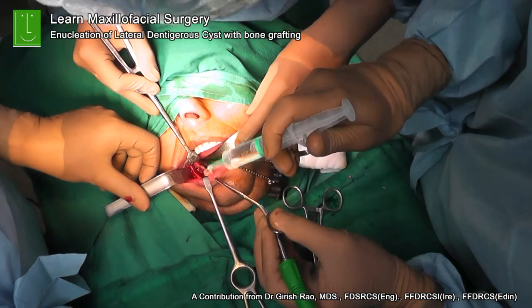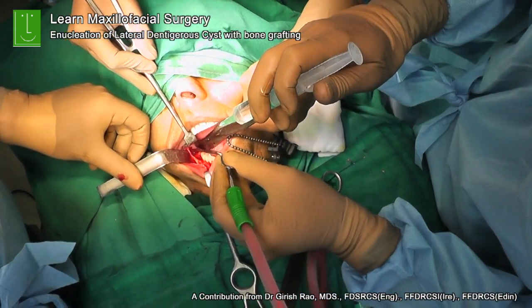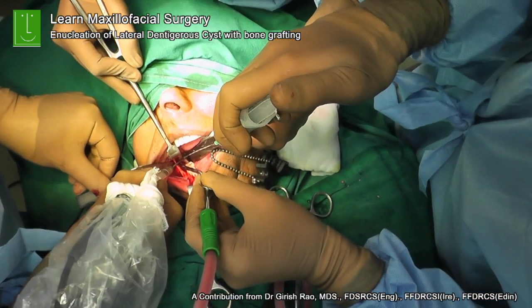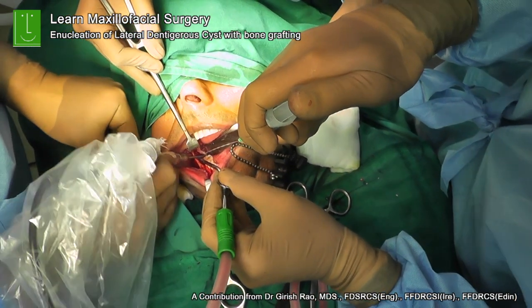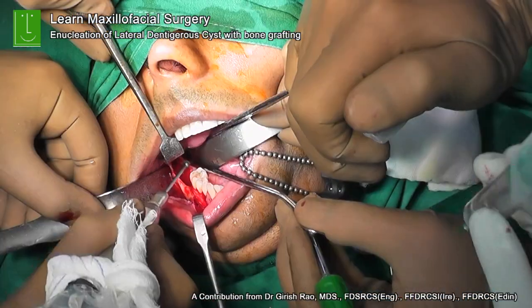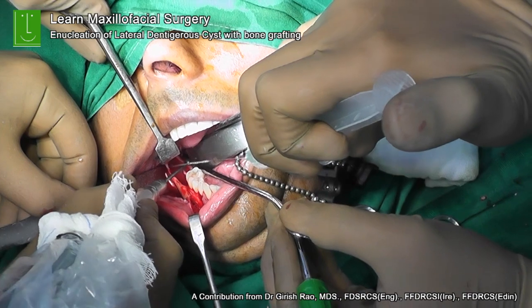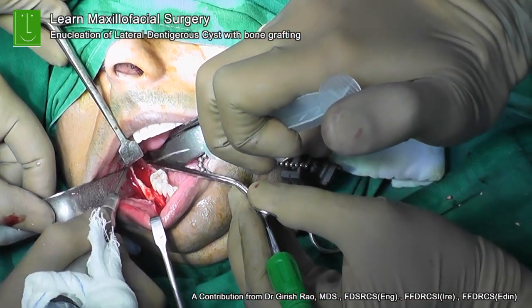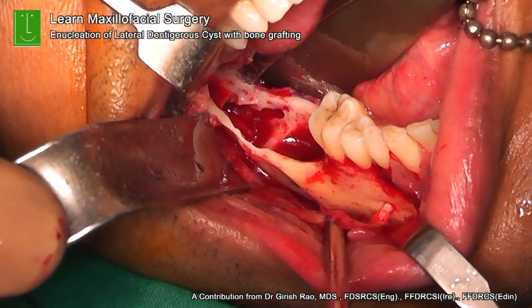Copious amounts of irrigation are used whenever you're doing any bone trimming or bone cutting, otherwise the bone can undergo necrosis. So you want viable bone in which we are going to put the graft. So it's very, very important that the cutting or trimming of the bone is done with copious irrigation too. And that's the trimming which we are showing there, the buccal as well as the lingual cortical plates.